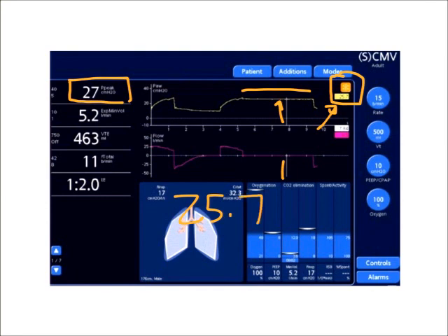and my pressure is 25.7. This is my plateau pressure, and I'm going to use this measurement as a guide to set my P-high.